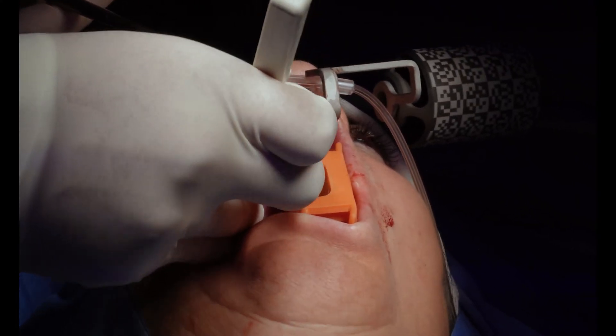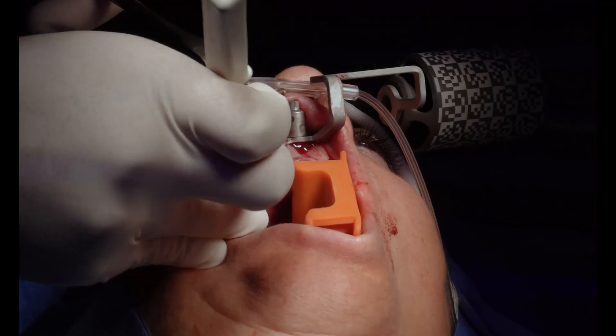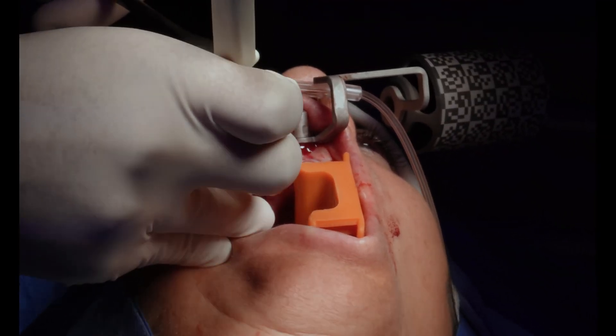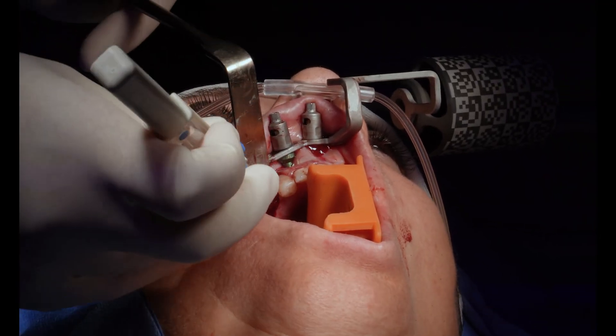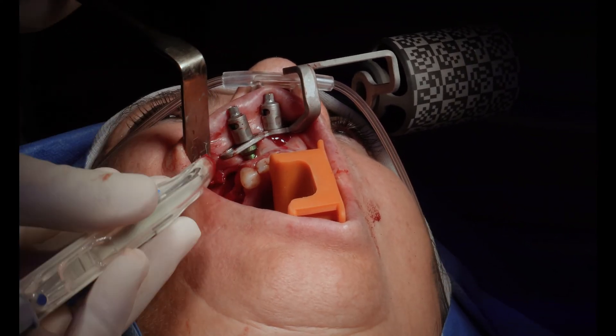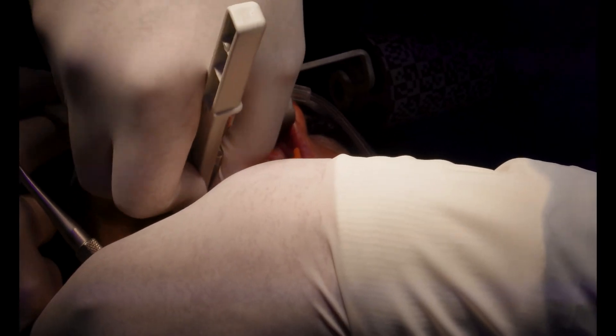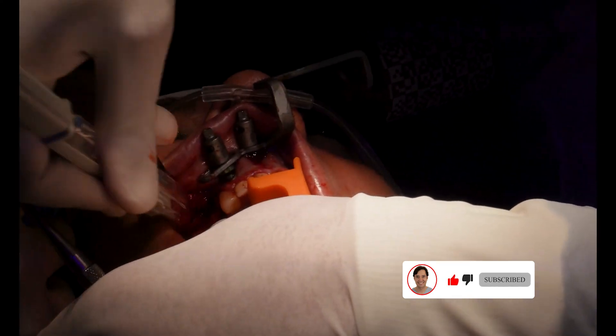After completing the drilling protocol for the implant, I start with bone scraping that I'm going to use for bone grafting in the sinus. In this case we make a mixture between autologous and heterologous bone. This is the scraping over the zygomatic buttress — it's a pretty straightforward process. I believe it improves the quality of the bone significantly at one year, so nowadays I use autologous bone regularly for almost all my patients.